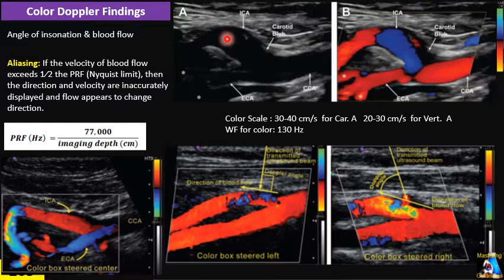That it can show by color based on what the color setup has been set up. It shows those Doppler shifts with color. Let's see a normal color Doppler on the carotid at the bifurcation and those two branches, how it looks and how we read them.